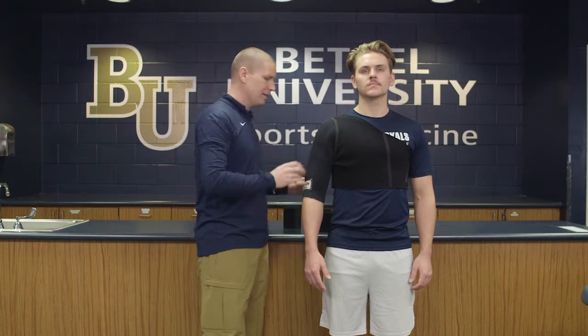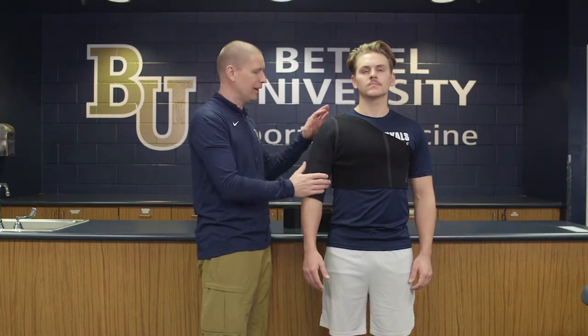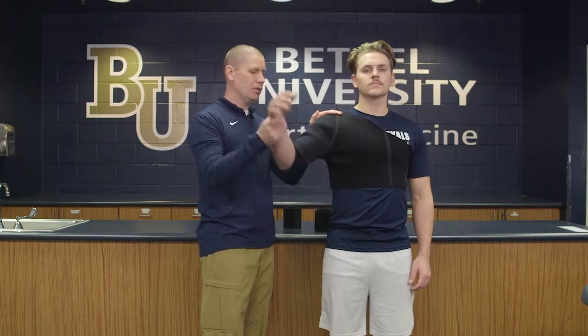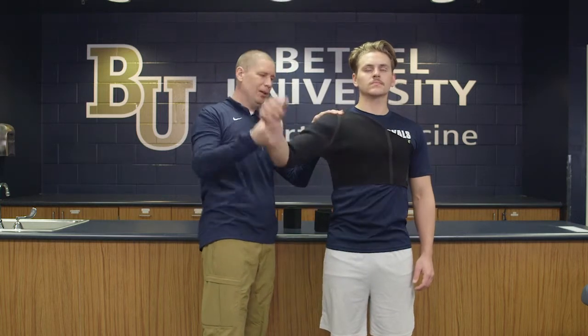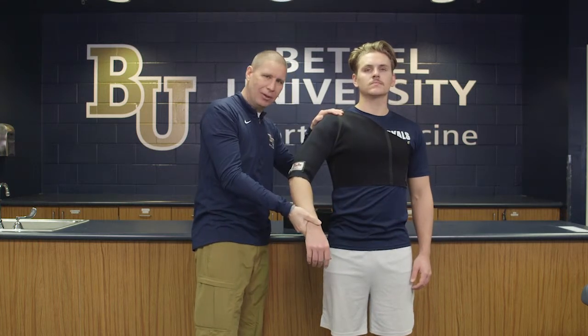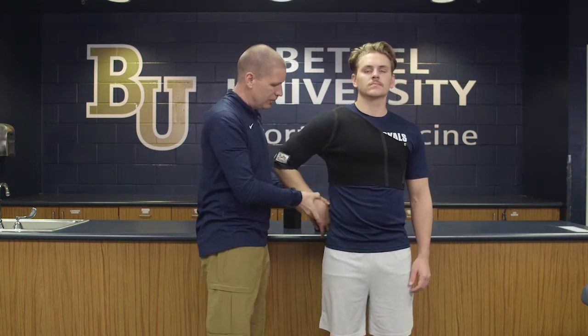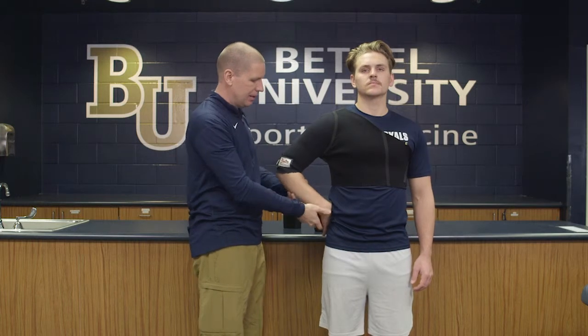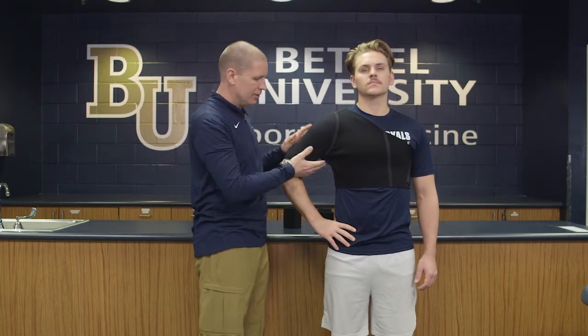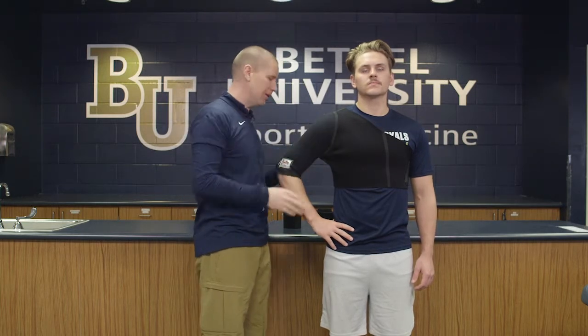What we're going to demonstrate primarily is how to protect against the most common injury, which is anterior instability. We don't want the arm to come up or come back, so we're going to pull the arm down and in. We're just going to place his hand on his hip for now — we want to pull it down and in, not have his arm extended out.